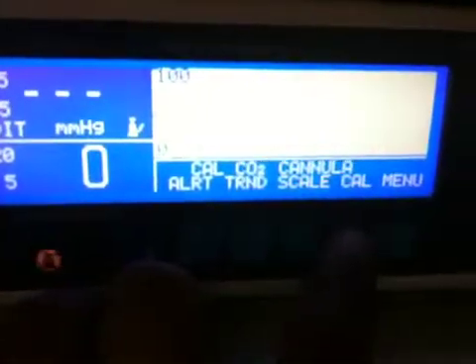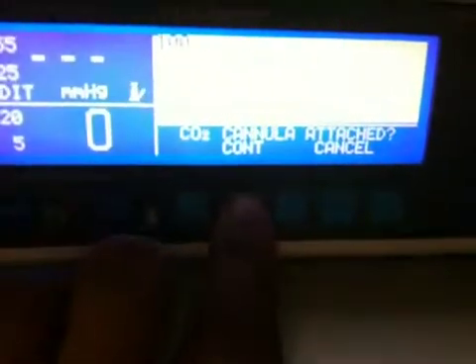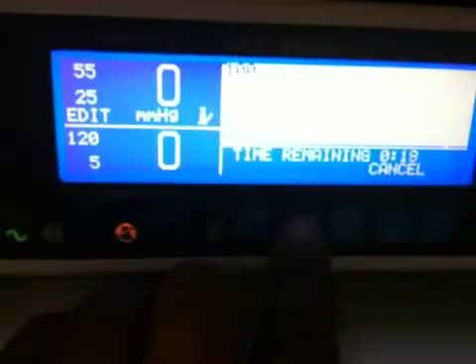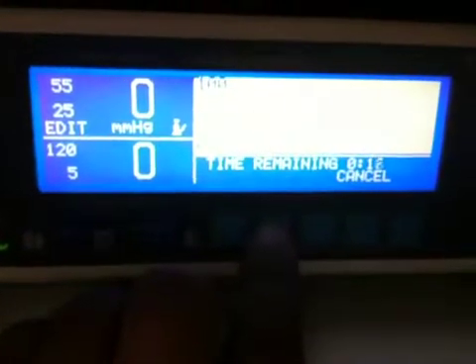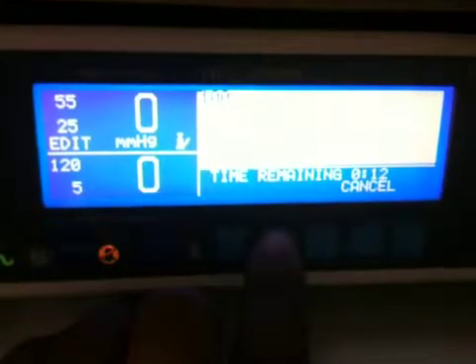And then, always press Cal and hit Continue and hit Start. Now it is setting for the Room Air.